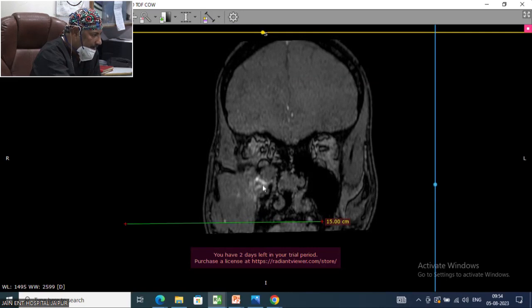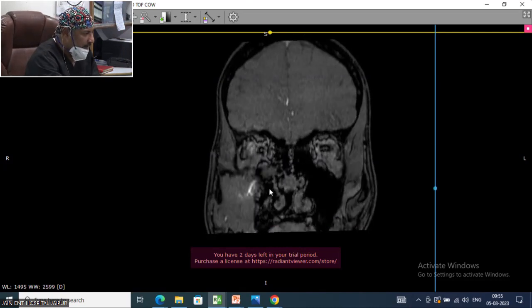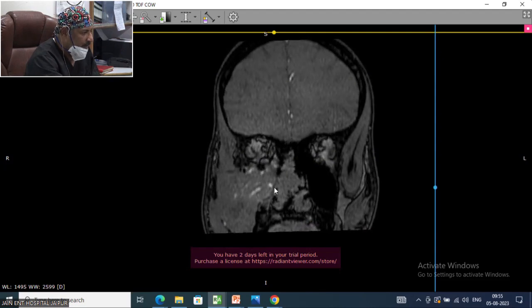My level of the maxillary artery here from the hard palate is more than 2.8 centimeter. Can you see? So once I open the posterior wall, I have to look for the maxillary higher up. Sometimes it is pushed inferiorly, sometimes it is higher up. And you really need to look at the vessel to devascularize the tumor. And it gives you such a great confidence where your artery is going to be.